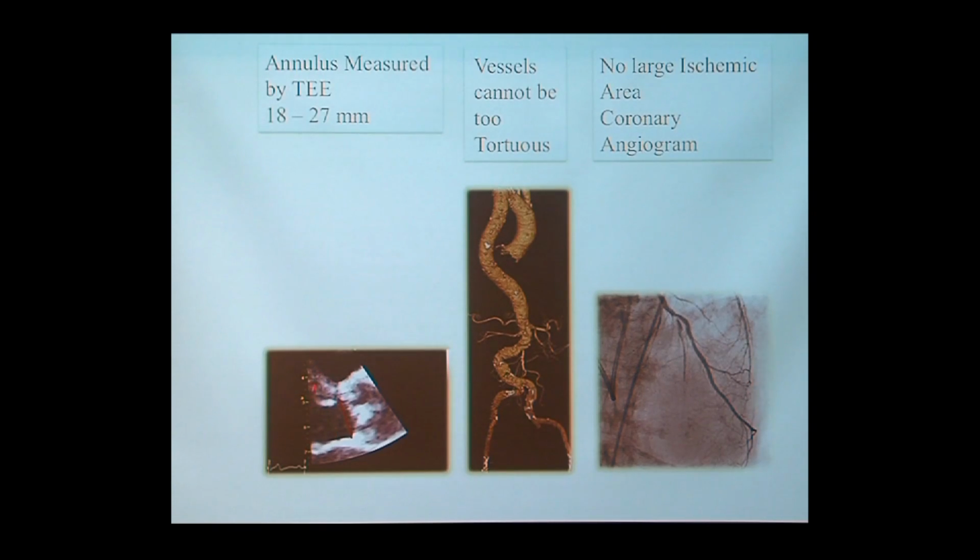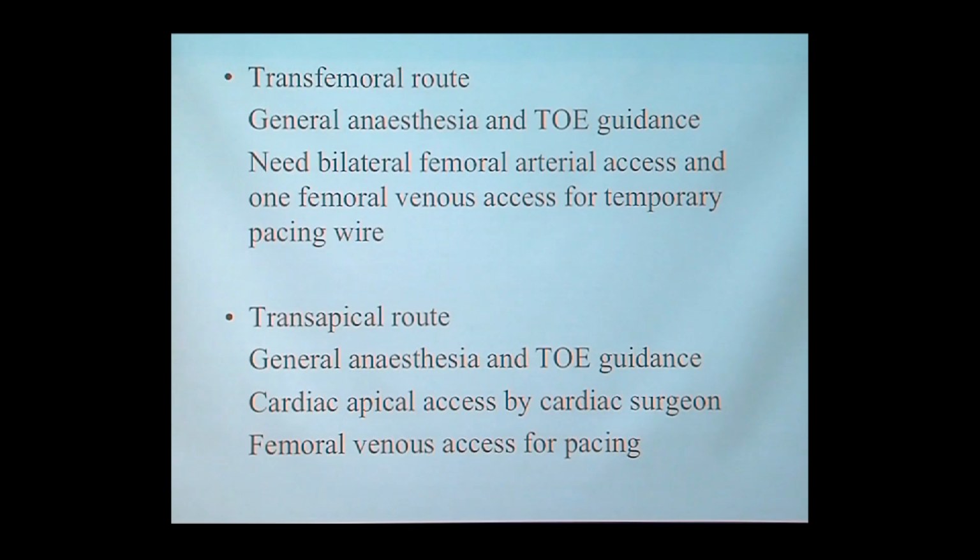And there are a lot of various workups we do. We do echo scans, we do CT scans. Now we have 3D reconstructions, which give you a real-life image. You can rotate this image 360 degrees and see exactly how the artery looks. So the amount of information we can get out of these things is phenomenally good.